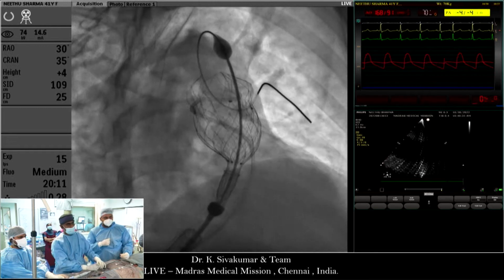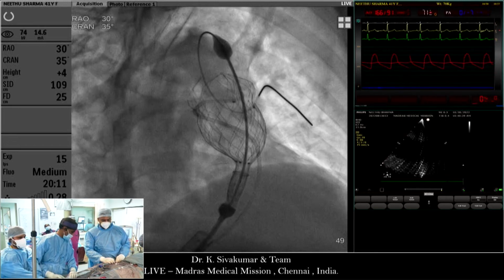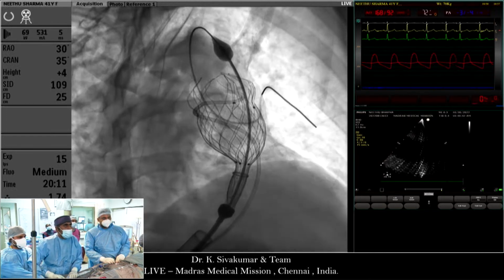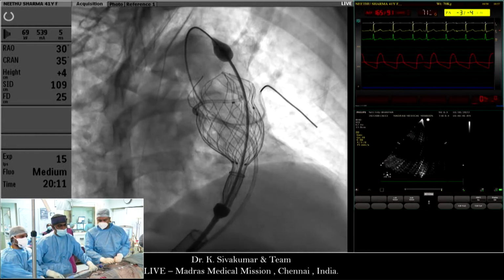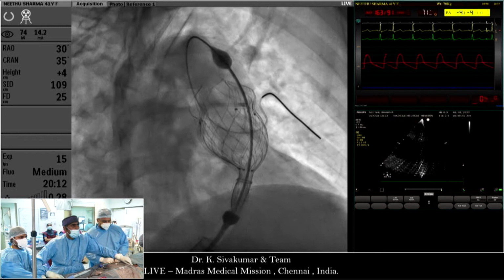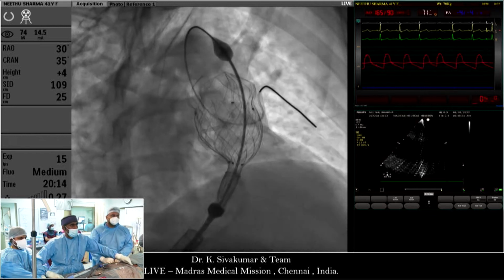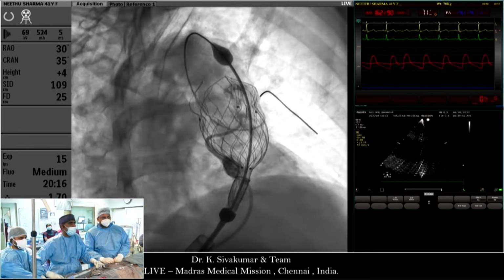Okay. So now, I think deploy it here. Maybe can you make one more angiogram, pushing the wire? Yeah, I'm going to make one more angio here. Please.